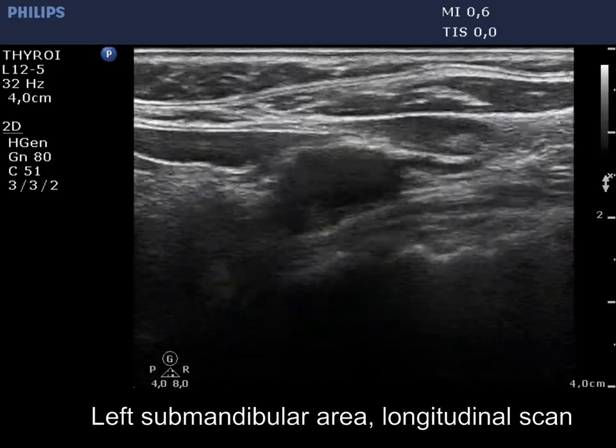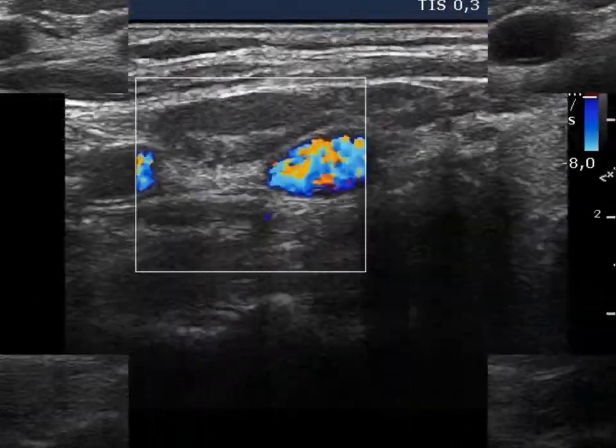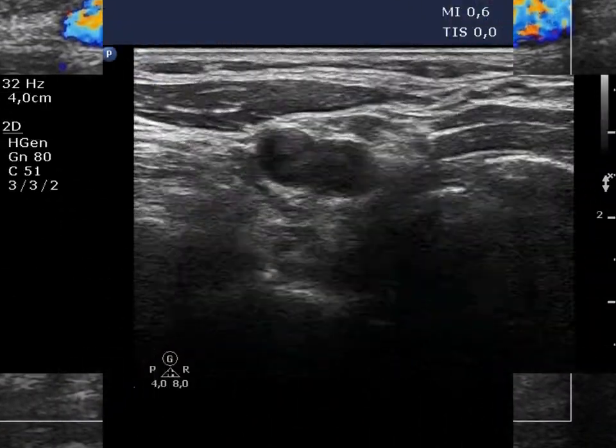Now, another larger reactive type lymph node is demonstrated. There is no vascularization on Doppler mode.